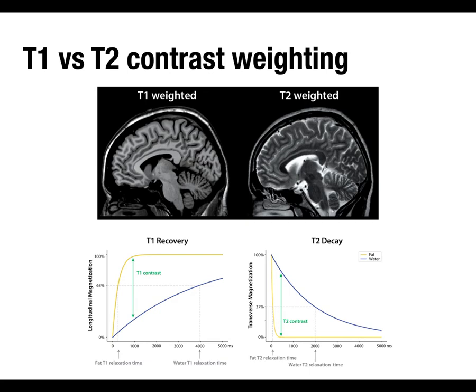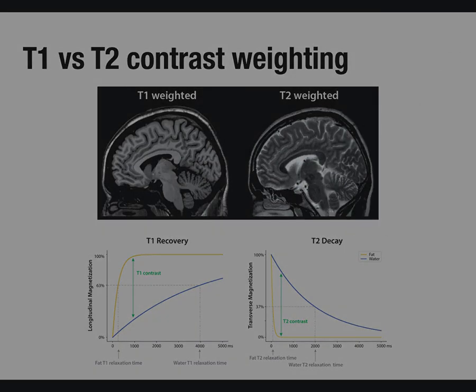So your echo time is basically being determined by that green line, that T1 contrast there, or your T2 contrast. So your echo time is when you want to read out from that. You set your echo time to a certain thing. And critically, you can get different contrast weightings, which we call T1 or T2, depending on various scan parameters, including what you choose that echo time to be.